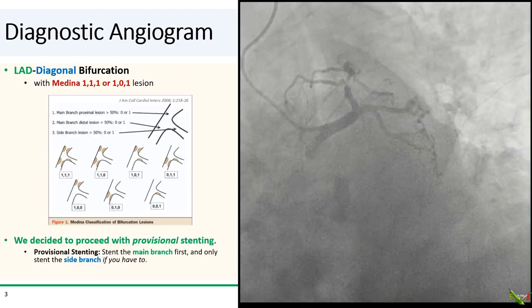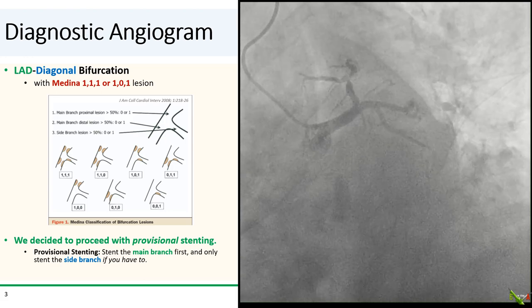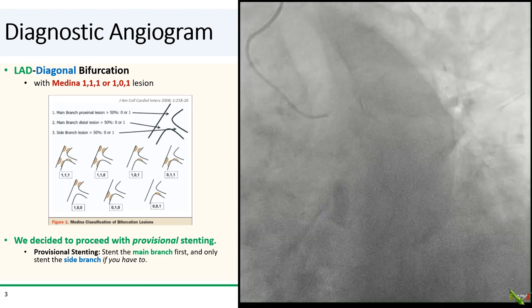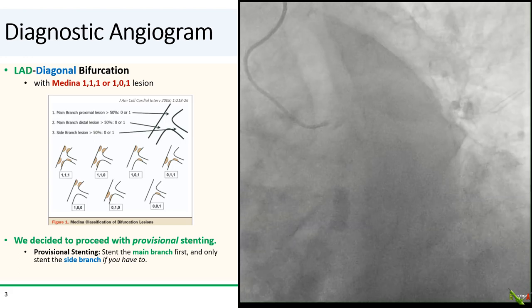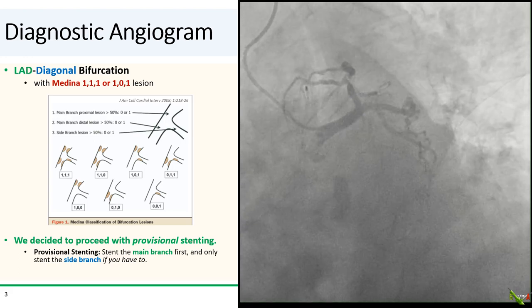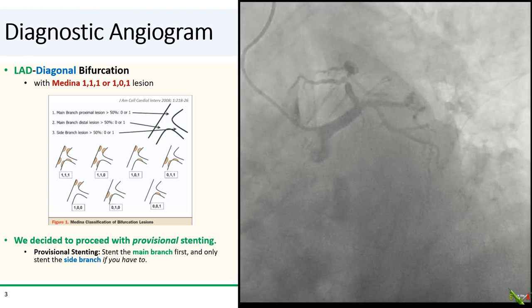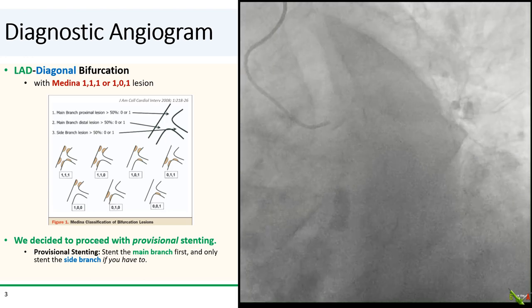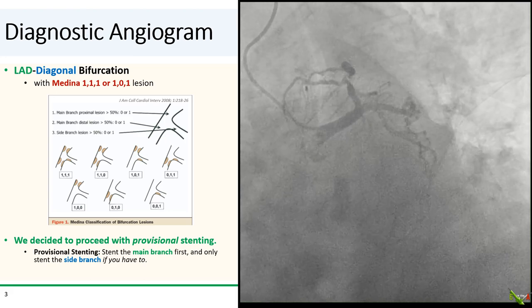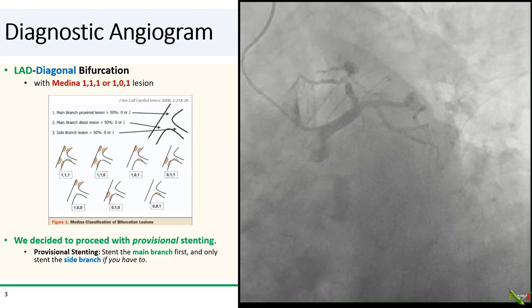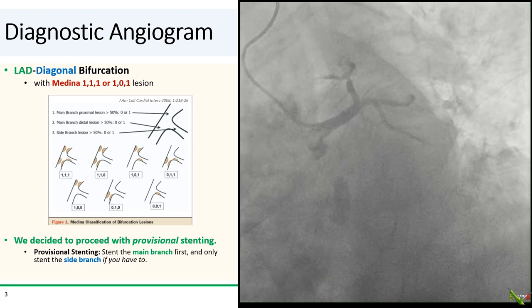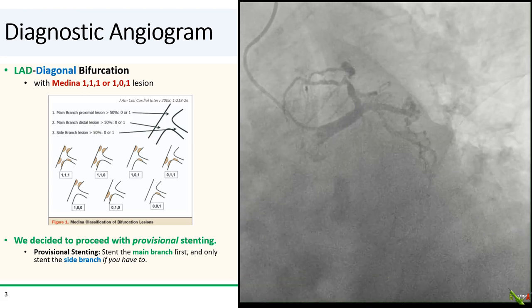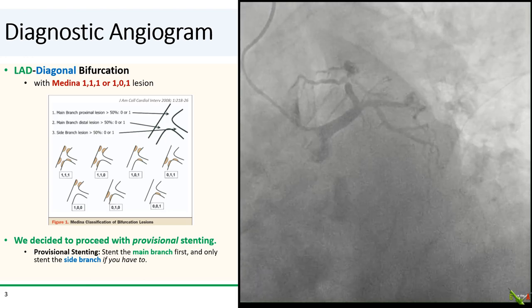Here is another view of the LAD. It looks like the bifurcation is either Medina 1-1-1 or Medina 1-0-1. Medina is a simple way of classifying bifurcation disease — you get either 1 if there is disease or 0 if there is no disease. The first number reflects presence or absence of disease in the proximal main branch, the second number is the distal main branch, and the third number is the side branch.